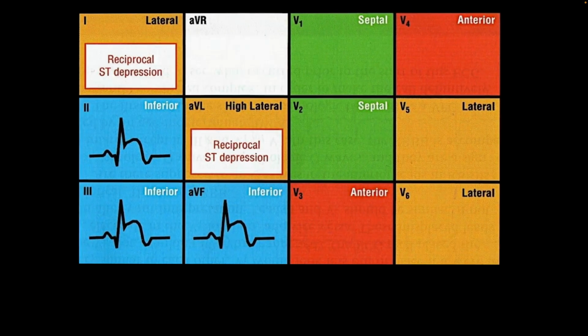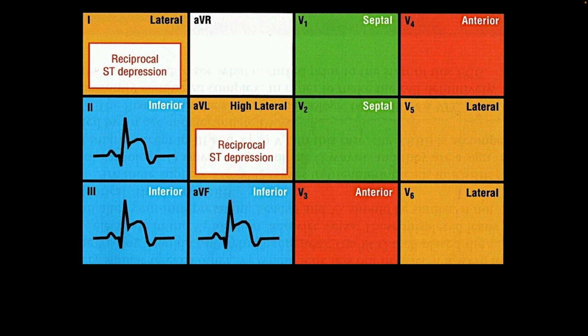Okay, so here's our little chart. It is ST elevation here, reciprocal depression here, the high laterals. Okay, not here, it's the high laterals. That's one of the reasons why having the distinction of high laterals is useful.